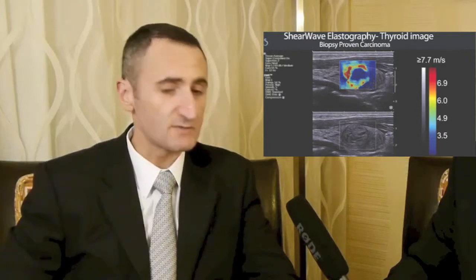Claude? Yes, as you know, ShearWave elastography is an imaging method which displays a map of the stiffness of tissue in color. And in any imaging method, every pixel that is displayed on an image is the result of a calculation. In ShearWave elastography, every pixel in an image is the result of the calculation of the speed of the shear wave that propagates in tissue, and this speed of shear wave is indicative of the stiffness of tissue.